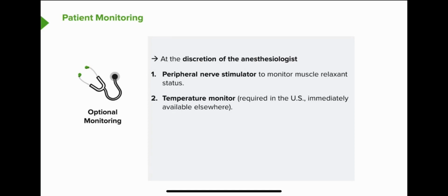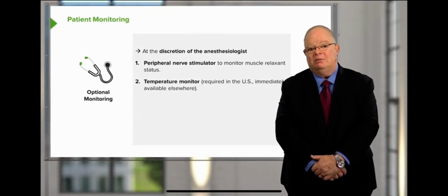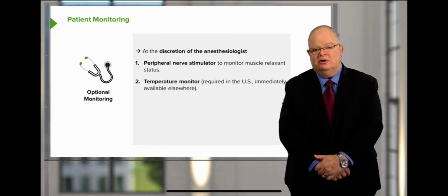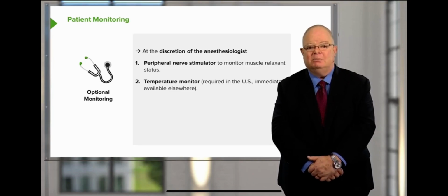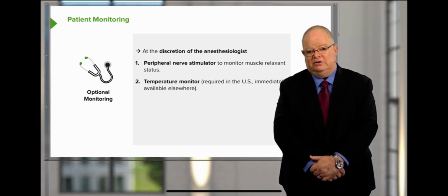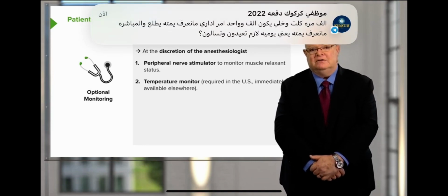Initially, it was introduced as a way to monitor for malignant hyperthermia, which we will talk about in more detail in a later lecture. But it turns out that temperature change is a late indicator of that disorder. So monitoring temperature for that disorder is probably not an important feature of temperature monitoring, but operating rooms tend to be cold and people lose heat in operating rooms, and there's danger in losing heat and becoming hypothermic. So most of us measure temperature on a regular basis as well.